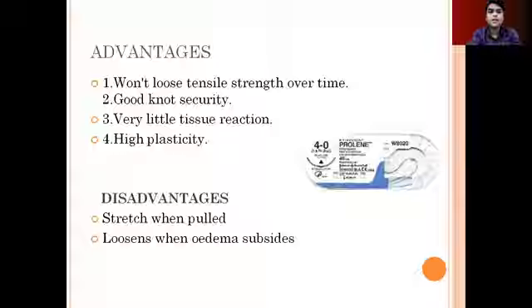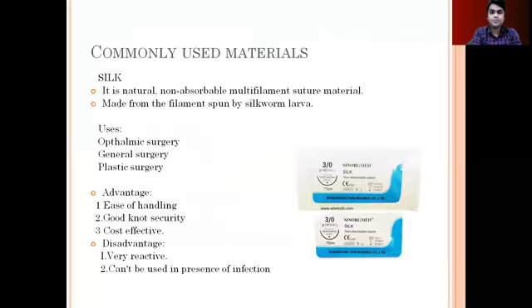The advantages are that it won't lose its tensile strength over time. It has a good knot security. It has very little tissue reaction and high plasticity. The disadvantages are it gets stretched when pulled. And one of the major disadvantages is that it loosens when the edema subsides.